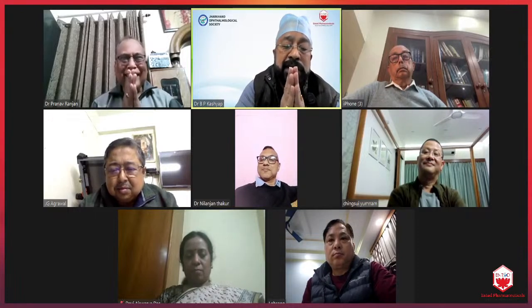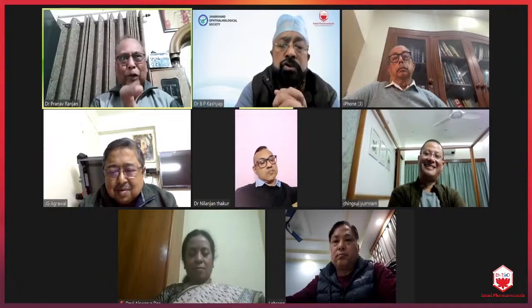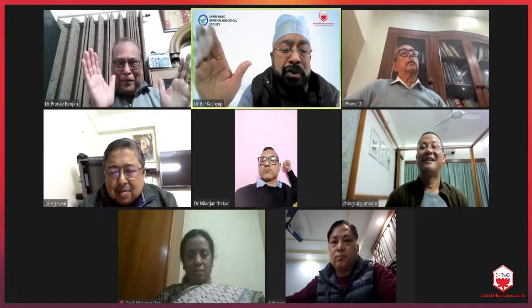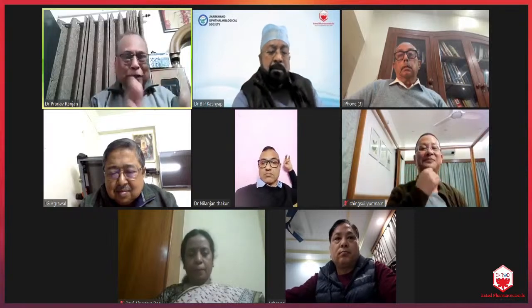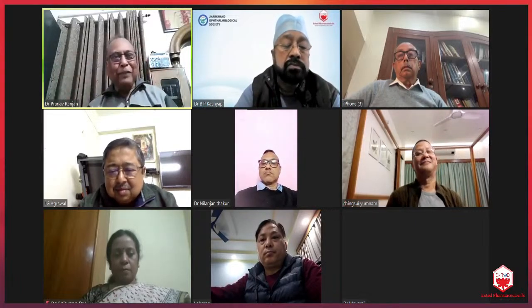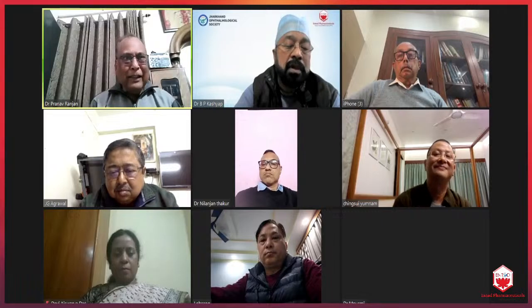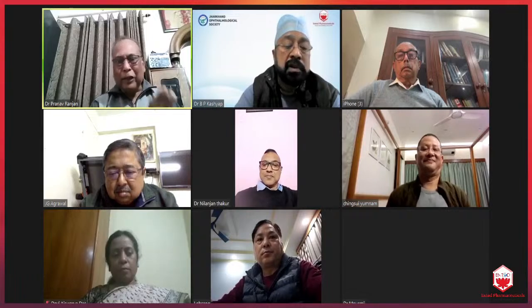Pranav sir, tell me one thing. No matter what you do, do you get 0-0? No. Why? I rely on what you said: 22 to 24, any formula is good. I rely on that. I've got an IOL Master, and I'm very, very happy with it. I've got an ultrasound machine that also gives good results. Theoretical things are always there, but I basically rely on those factors you just mentioned.